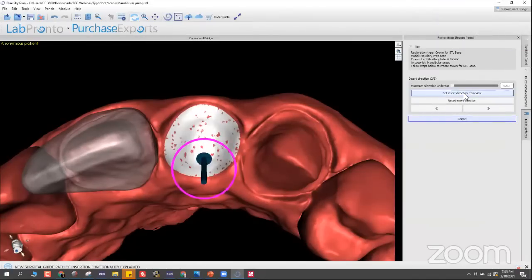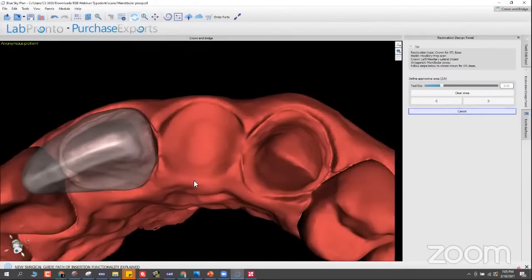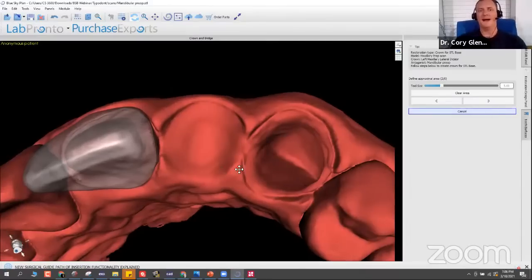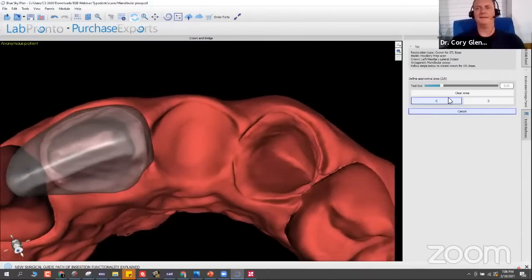Okay. What is the longest edentulous space in a full arch provisional that you have successfully designed? Longest edentulous space, all the teeth, because I've used these on full arch hybrids, so there are no teeth in those. But I'm sure it says on the indications, because that's usually something that has to be included on the FDA form when they're getting approval. I just don't know what it is off the top of my head, so you might have to pull up the insert for that.